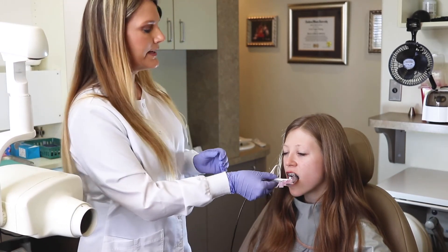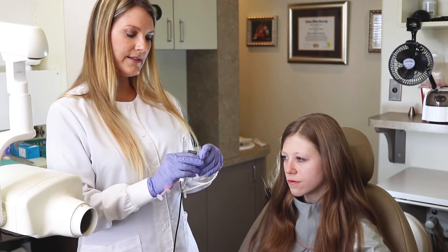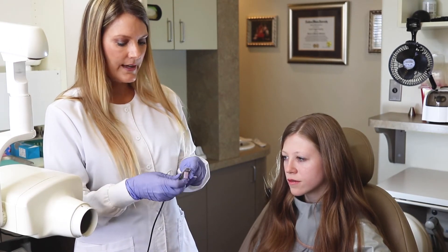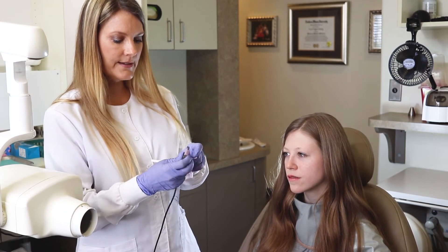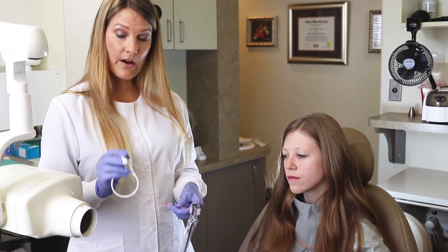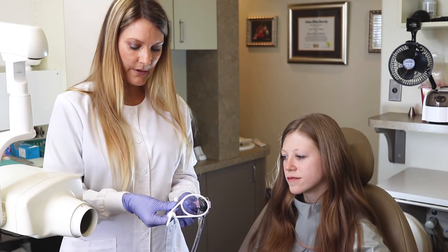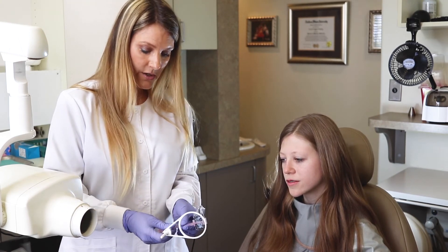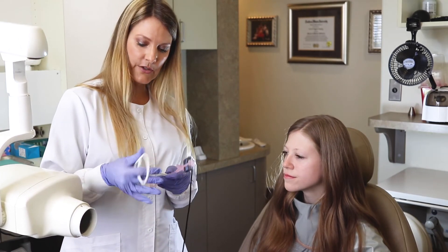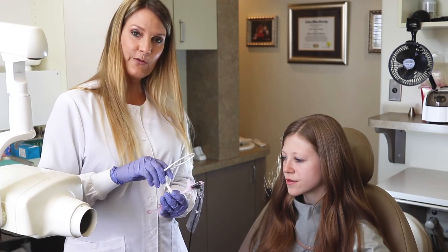Now that our posteriors are all taken care of, we are going to move to the anteriors. So I'm going to go ahead and slide the sensor out, removing it from the sensor clip holder. You can either tuck this in where it just snaps in, or you can slide it up, and we're going to take this off. The nice part about this is if for some reason you end up putting this on going the wrong direction, the ring actually slides off, and you can just go ahead and put it in the correct direction.